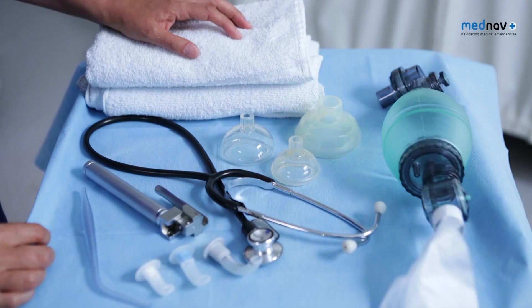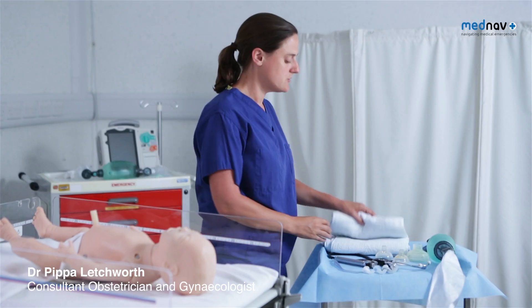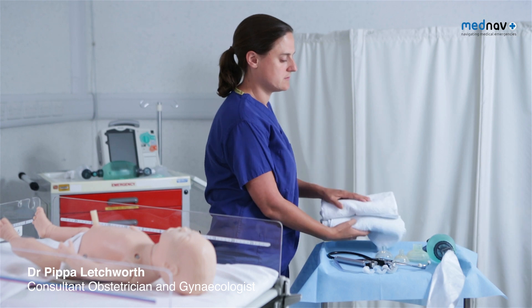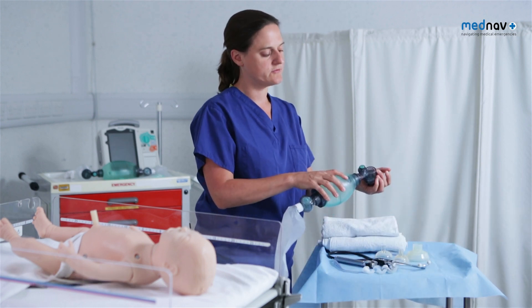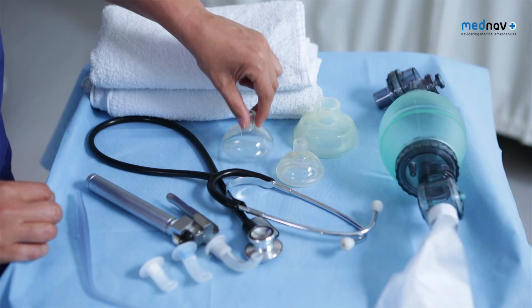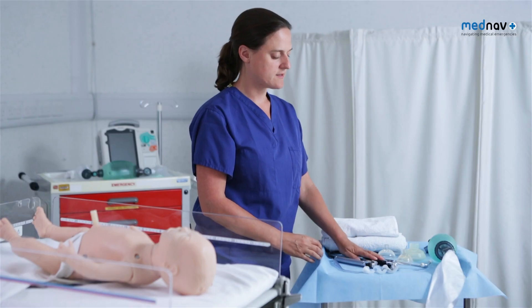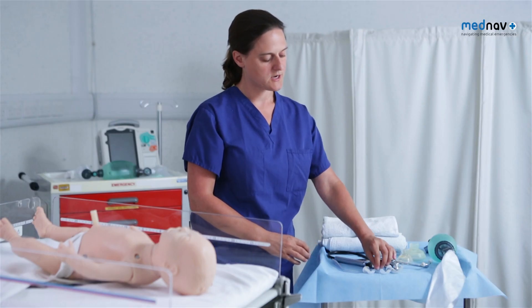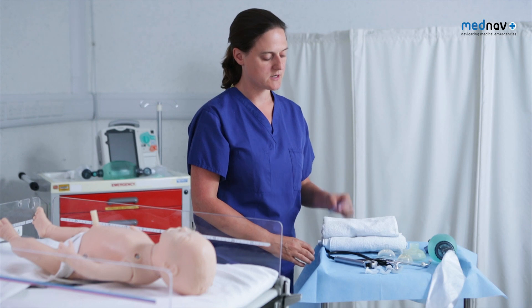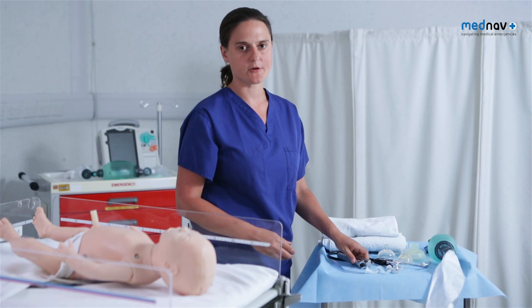First, prepare for delivery and potential resuscitation. You will need a flat surface, two towels, an ambi bag with a pop-off valve, different size masks, a stethoscope, different size Gudel airways, suction, a laryngoscope and a clock.